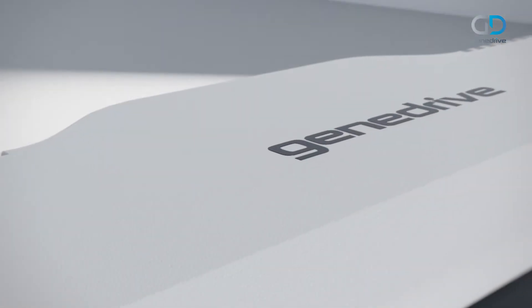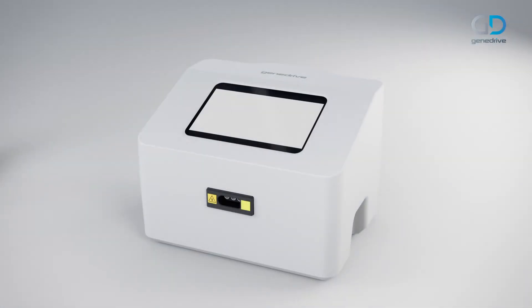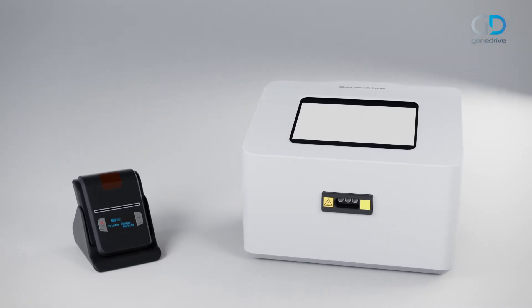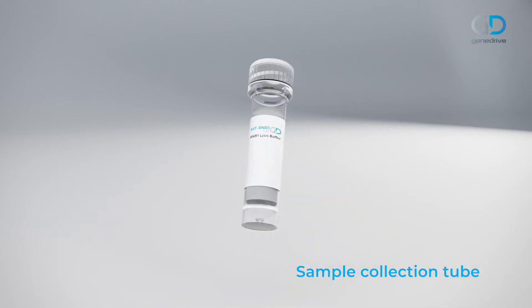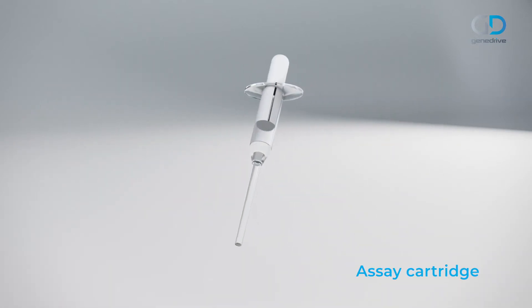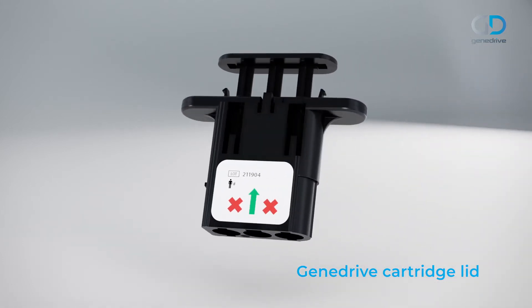To run the GeneDrive MT-RNR1 ID Kit you will require a GeneDrive system and an optional label printer and labels. The components of the kit are one buccal swab, one sample collection tube containing lysis buffer, one Minivet, an MT-RNR1 assay cartridge, and one GeneDrive cartridge lid.